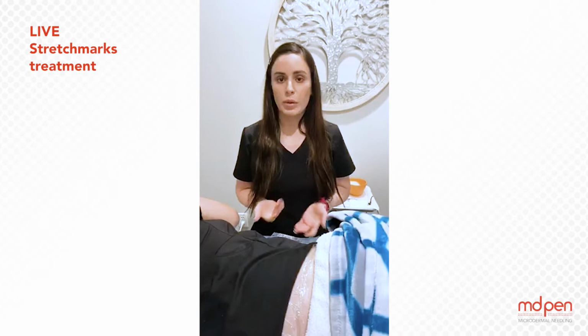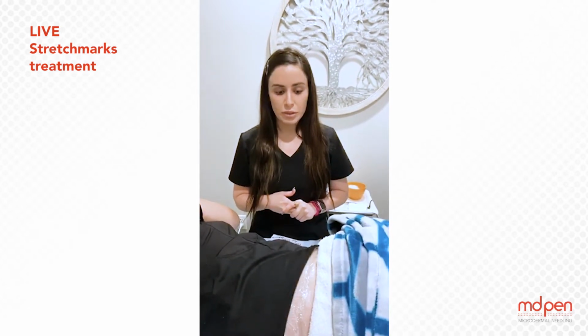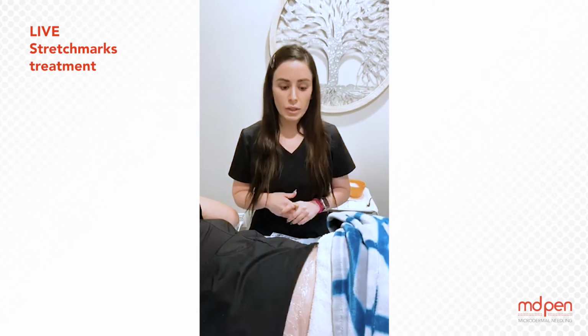So you want to be starting at about a 1.5 millimeter depth minimum. You may be fine at that depth. You may end up going up to 2.5. It just depends. So this is definitely a treatment that's meant to be done under a doctor's supervision in a medical spa or medical office. I don't recommend for estheticians to do this on their own. Like I said, it is done at a high depth.